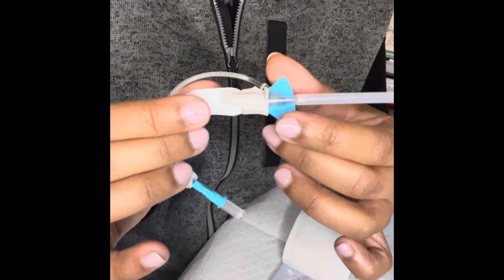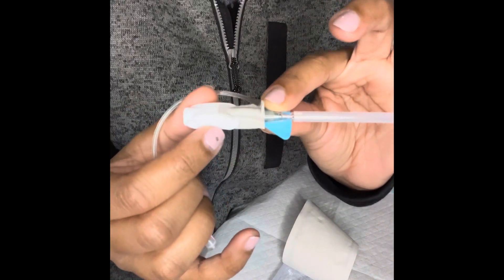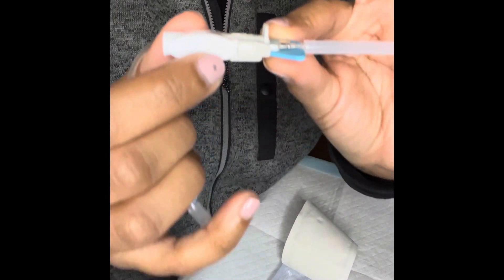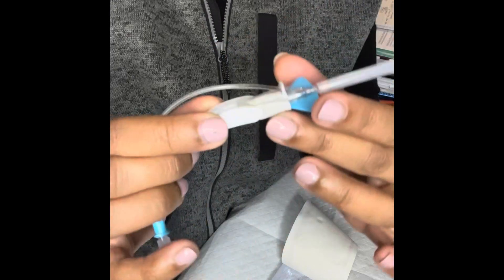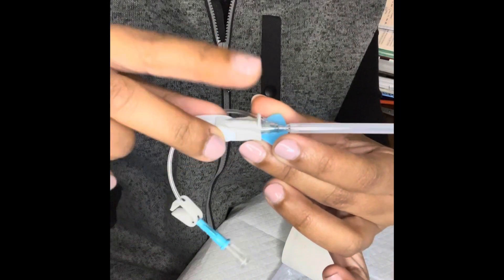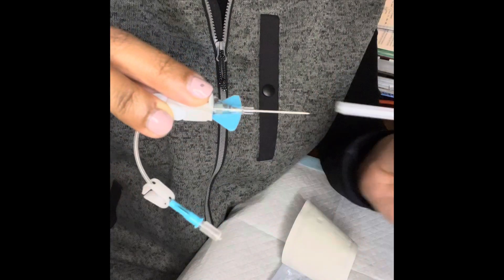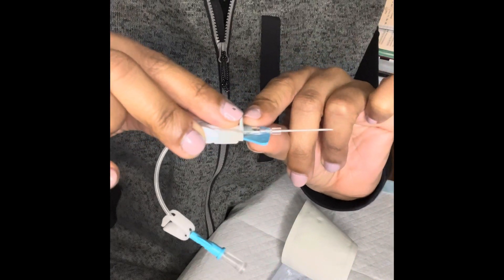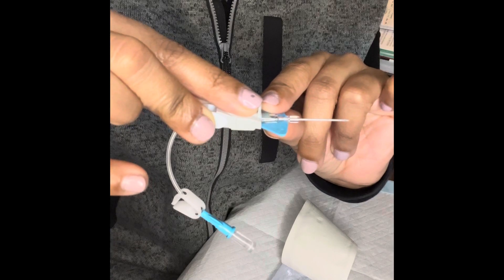Second thing you want to do — on the Nexiva catheter, we like to have a process called breaking the seal. Your Nexiva catheter has two movable portions: your gray push tab and your white finger grips. These two pieces separate when you are threading your catheter into the vessel. You want to do a very slight disengagement of the two and then engage it back together. This is breaking the seal.